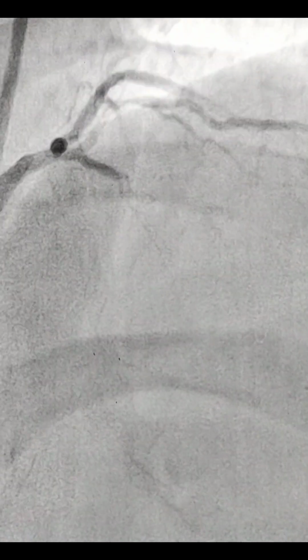It was almost 2 hours, so we'll plan this procedure later. So this was the final scene. You can see there is a segment of almost 20 to 30 mm of CTO with a hard proximal cap, and you can see the retrograde filling of the LAD. So it was an attempted CTO of the LAD, and we will plan it later. So this was the angioplasty to the RCA and CTO LAD.